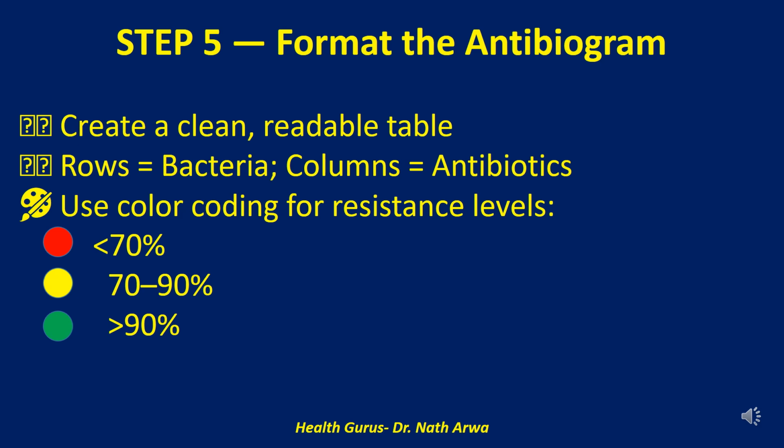Welcome to step 5. Formatting your antibiogram, where raw stats become clinical gold. First things first, presentation matters. Your antibiogram should be clean, organized, and readable at a glance. Think of it as your lab's cheat sheet for empirical treatment. Use a simple font, avoid clutter, and keep the layout tight. No one wants to squint at spaghetti data, especially not a clinician making decisions at 2 a.m.